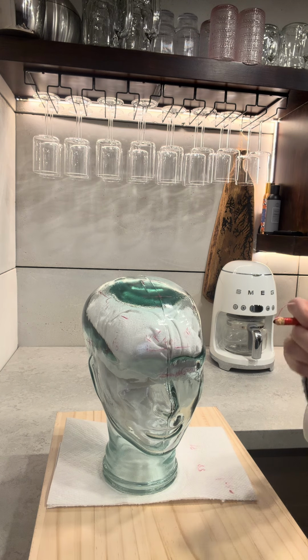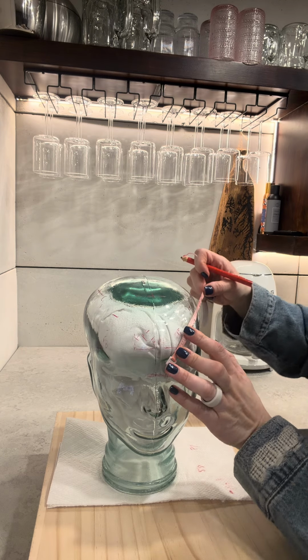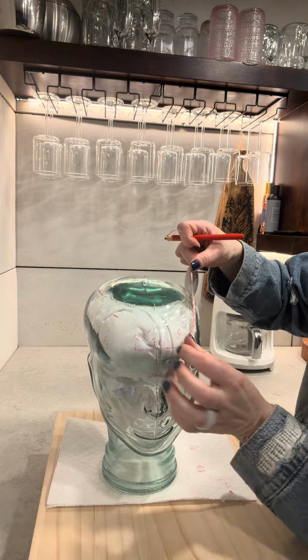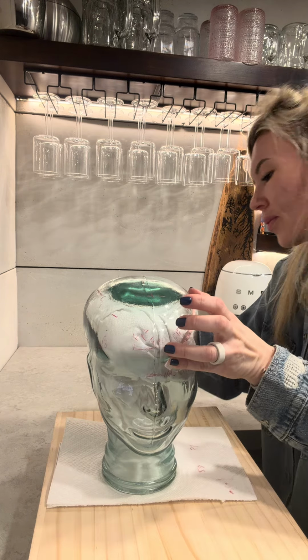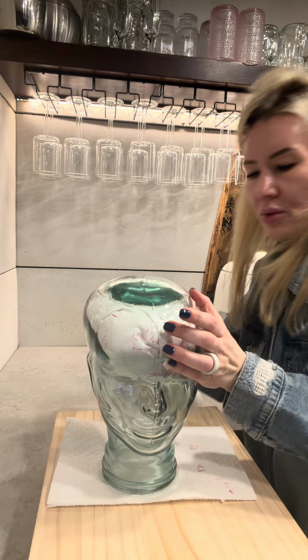Now, right, left parasagittal, Fp1 through C3 to O1. It's 26. Okay. So 6.5.